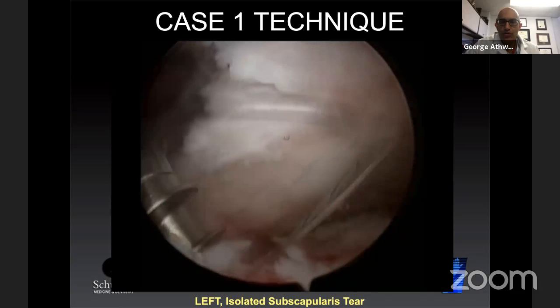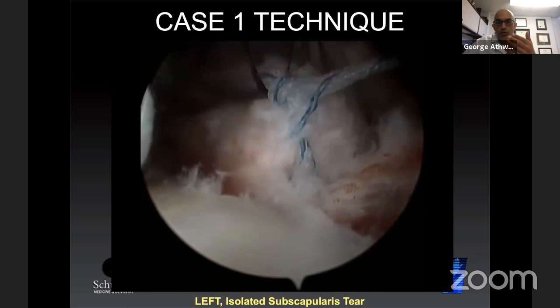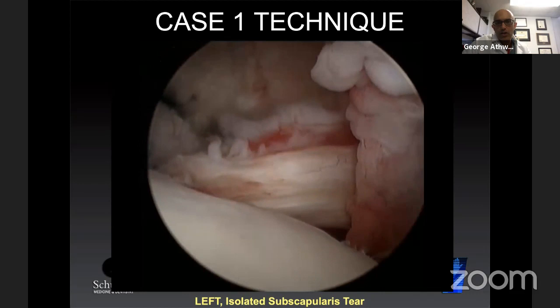So we have three anchors, starting from inferior. I pass all of my sutures from inferior to superior, and then tie superior to inferior. The reason I like to tie from superior to inferior is that I like to really reduce that upper border. In this case, because I placed this anchor medial, I could have done a double row. If I didn't cut these sutures, I could have put a transosseous equivalent knotless anchor into the biceps groove. But with three anchors here, it's a fairly solid repair.